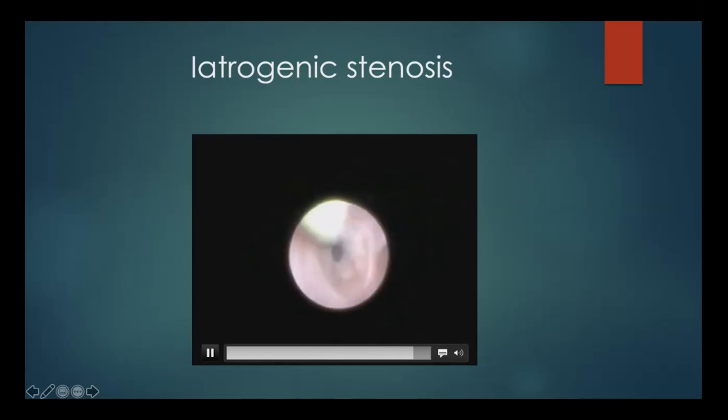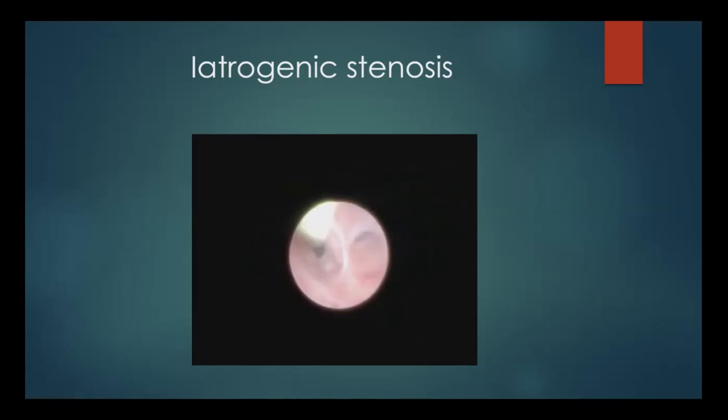Now this, I'm using quite a big endoscope. I was using a 2.3 millimeter endoscope. So if a 2.3 millimeter endoscope can really go in through your stricture, you're generally good. Of course, you do a check after some time as well, because you have a late stage stenosis with laser cases.